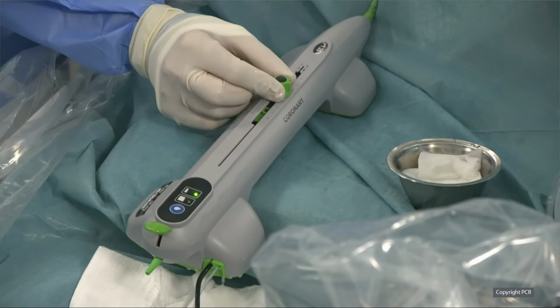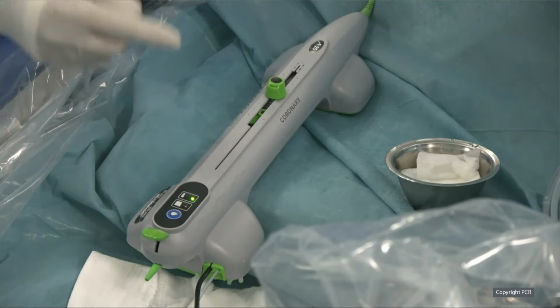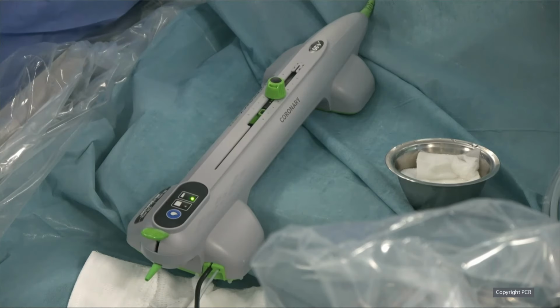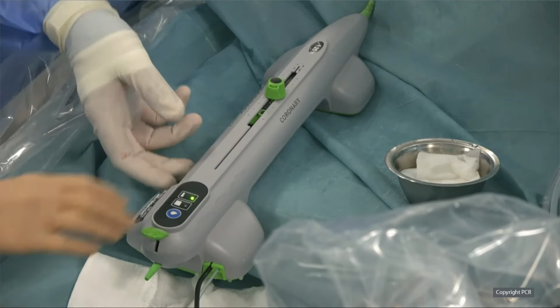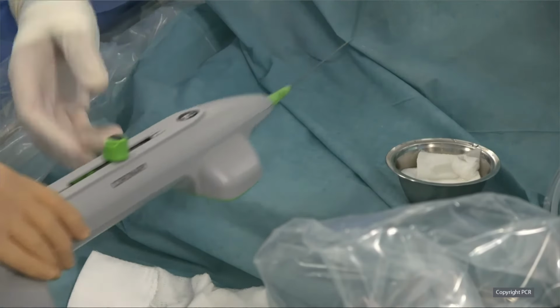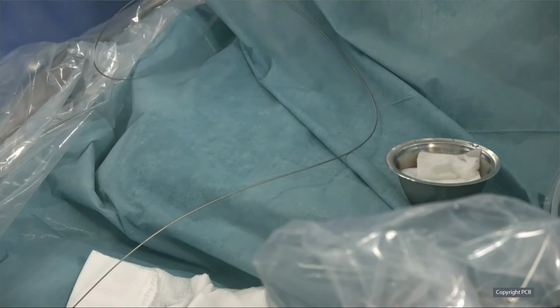And then you have two different speeds for rotation, 80,000 and 120,000 RPM, which increase the orbit of the burr. So remember, the burr has two ablative movements. One is on itself, and the other one is performing a big orbit. Can we hear the sound, Javier? Because the sound is self-telling. Absolutely. So we're going to put it on the wire now, on the Viper wire.